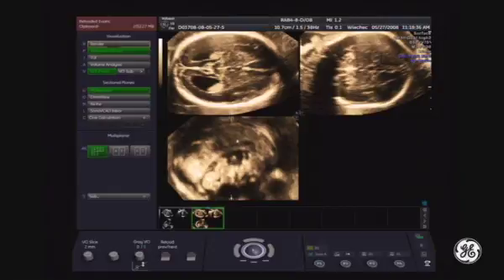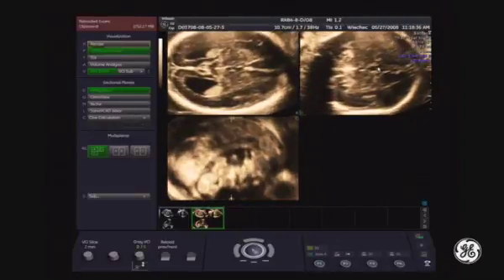And let's have a look at the B plane, which is the coronal cut of the fetal brain, and see the very, very characteristic feature, which is the three-line sign. The midline presents the falx, which reaches here the roof of the third ventricle, because this is the third ventricle. And why do we have three lines here? Because of the separation of the two hemispheres.